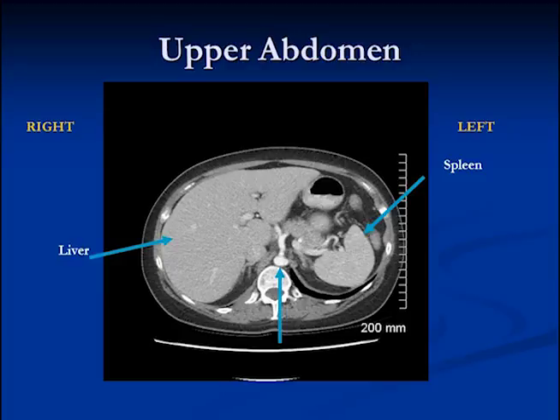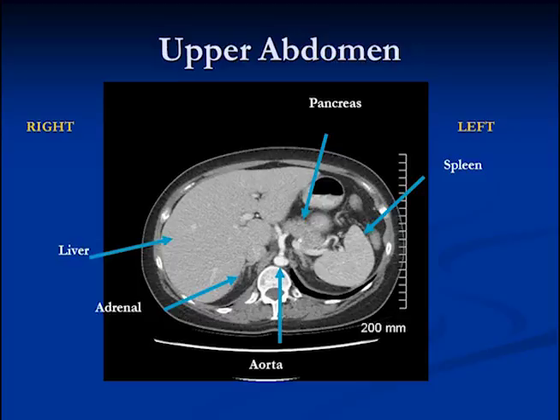Other images we'll see in the upper abdomen include the aorta. These little triangular-shaped hats are the adrenal glands, one on each side. This is part of the pancreas sitting here in the center — it has a sort of fluffy texture with more fat in it than many other structures. These are vessels going around the pancreas, including the splenic vein, which sits on top of the pancreas. This is the air bubble in the stomach, and we get a little bit of lung coming in here as well.